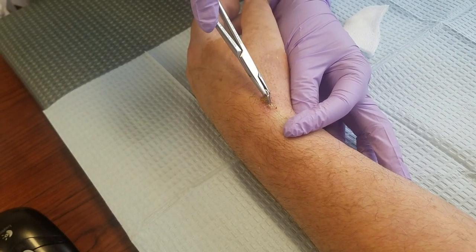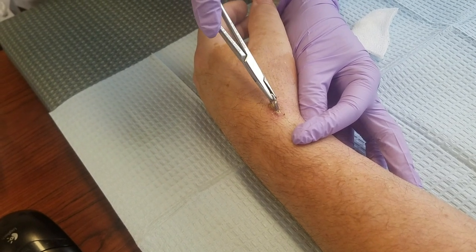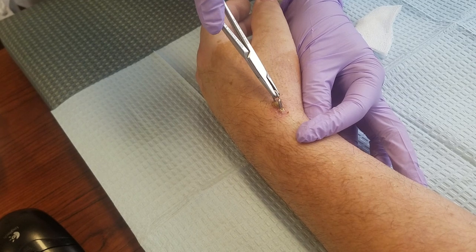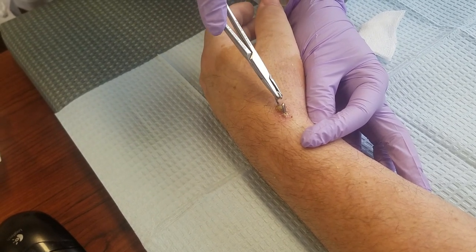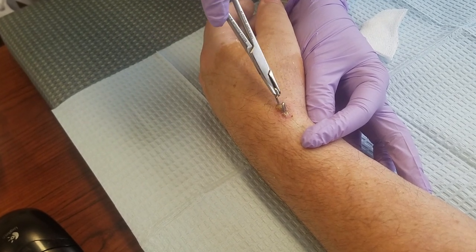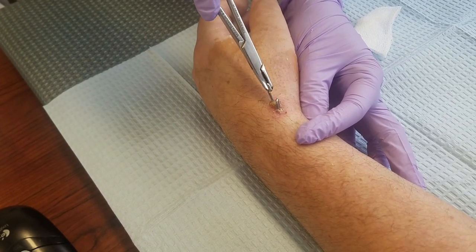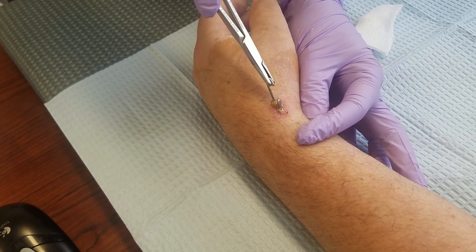It takes a few minutes and we just kind of gently work it back and forth until they slide out. They usually kind of have a good grip and then sometimes just let go. Is that weird? Yeah. Is it hurting bad though? No, it doesn't hurt at all. So I had an accurate description — it feels weird. That's just weird, yeah.